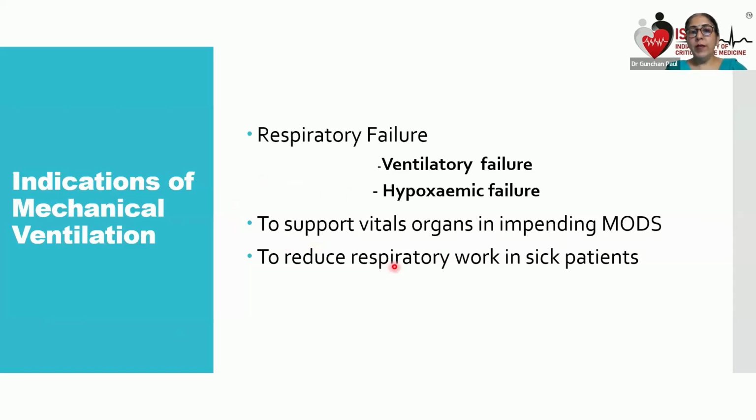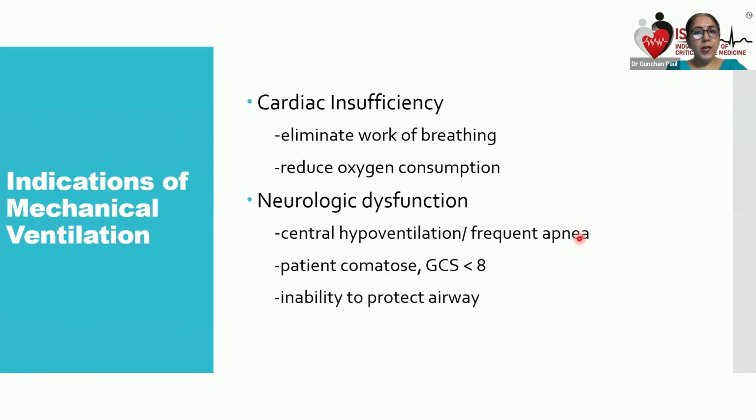We also use mechanical ventilation to support vital organs in patient of multi-organ dysfunction syndrome, like a patient of septic shock. So septic shock, patient is in sepsis, his BP is low, and he's breathing very fast. So we give him mechanical ventilation to support other organs of the body and to reduce the respiratory work. So similarly, in patients of cardiac insufficiency, supporting respiratory system in such patients will reduce the demand on the heart and allow them to recover.